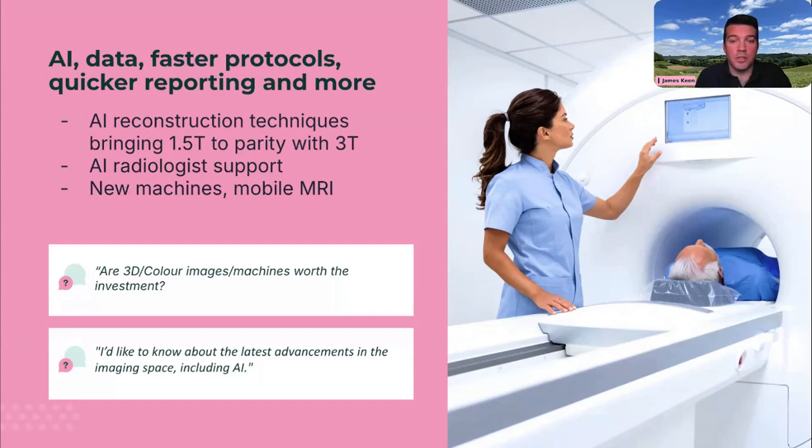I suppose, just to reiterate what you said with color, from an MR point of view, color in radiology tends to add an extra dimension to the imaging. You'd normally be looking at raw anatomy in black and white. Any attempt to use colors just tends to add busyness, which makes it very difficult to discern anything from the images. But Doppler ultrasound is a great example where there's a physiological component that we overlay, and that's where color does have its use.